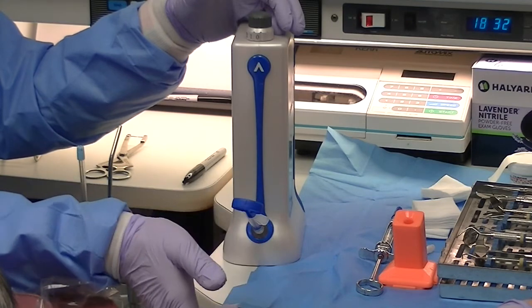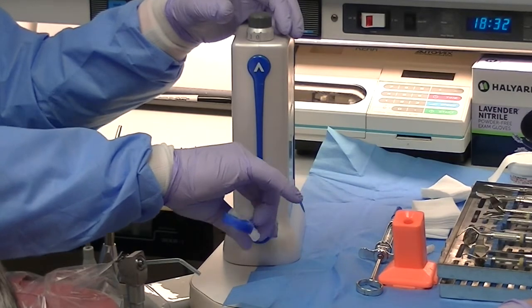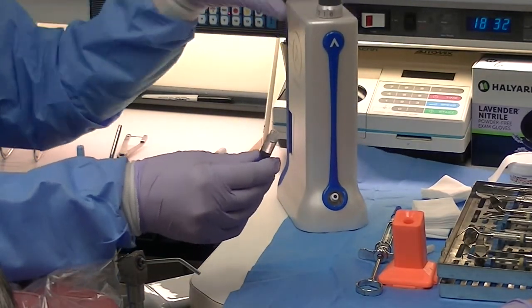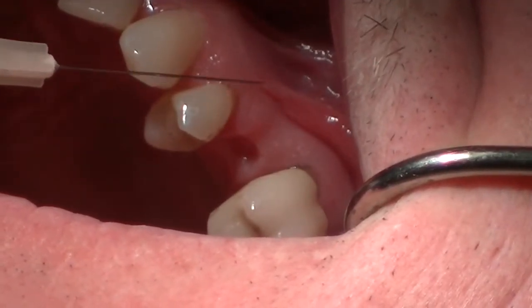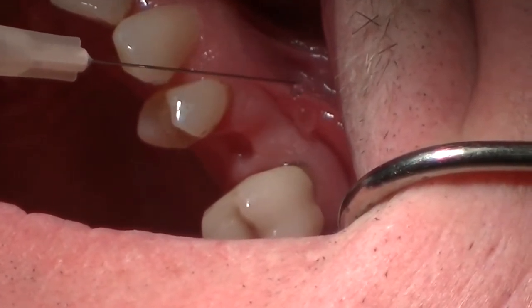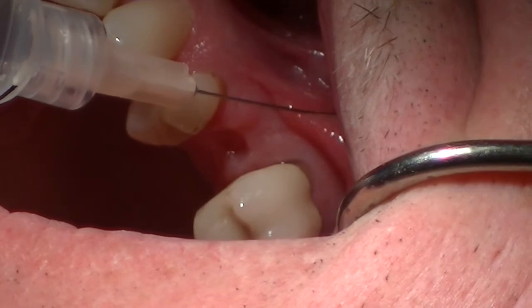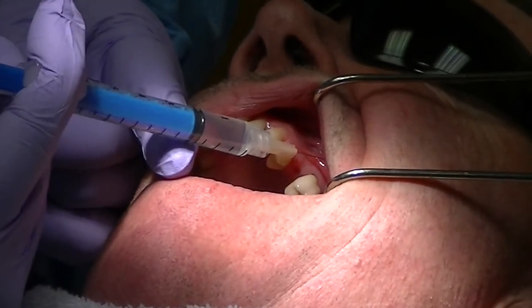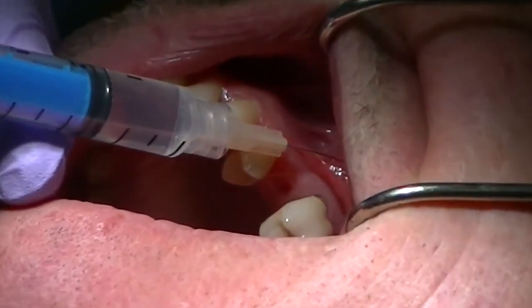Here we're simply using the instrument, drawing out our anesthetic — our lidocaine and sodium bicarbonate. It's just a prepackaged system. We'll shake it, and then we have a disposable needle. We will simply dry the site, and we're not going to block this area at all. I'm just going to infiltrate into the vestibule and kind of walk my needle up the ridge to the palatal. Here I'm just going to drip a little anesthetic onto the site, and you can see I use no topical in this situation. I will simply drip and wait about 10 seconds and inject. About 80% of my patients don't experience any discomfort with this injection.